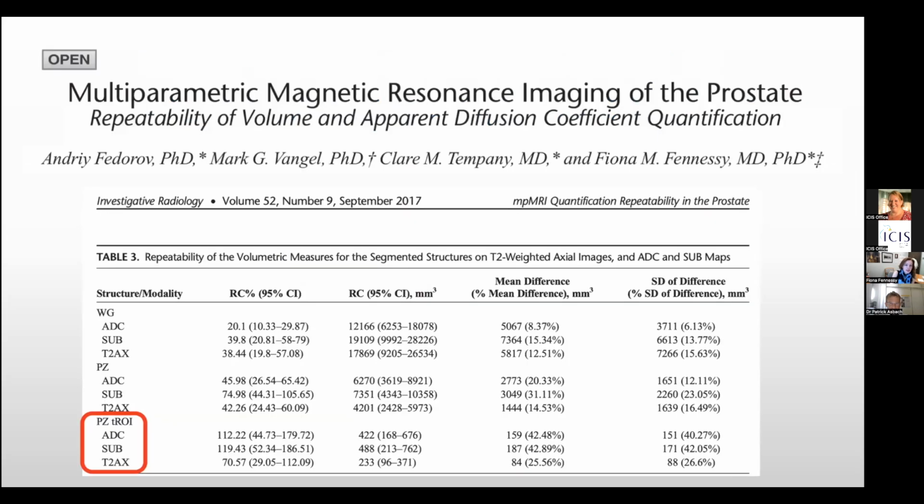The other thing to keep in mind is that if a patient comes in today and we outline the tumor, and then they're going to go and get treated, we outline the tumor on our MRI images, and then we fuse them for ultrasound, and they get ablated, or we use MRI-guided ablation. It's important to know that physiologically, the actual tumor may not be the same measurement if you measure it a couple of weeks later.